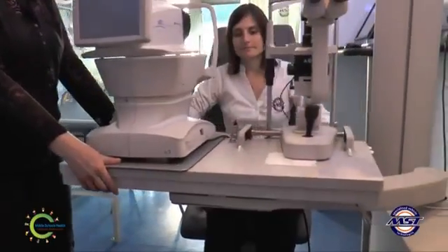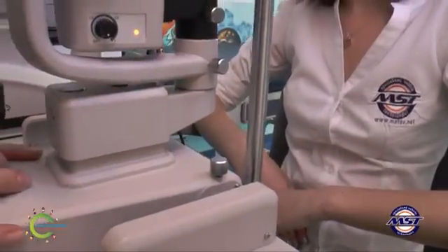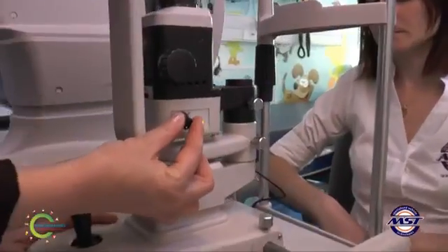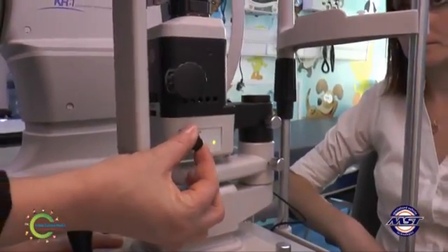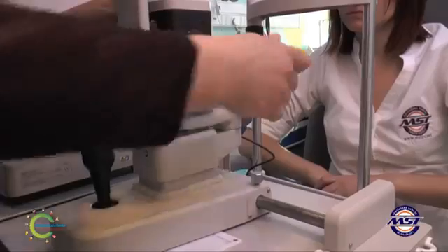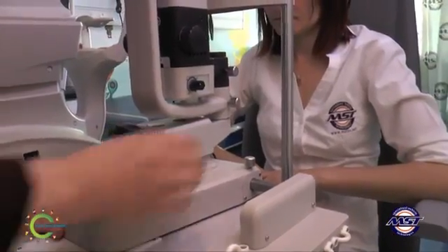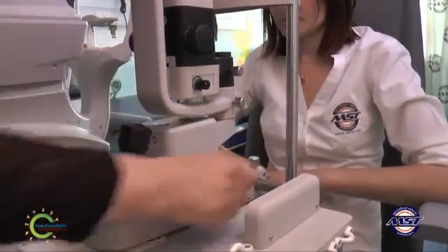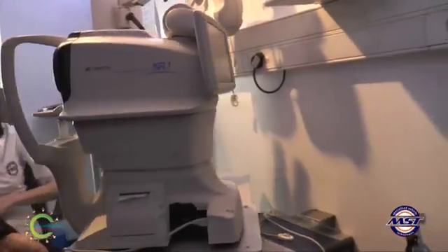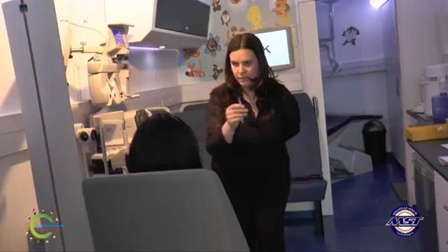The table slides across until clicking into place. Turn the slit lamp on with the button on the side, the orange light will turn green. After completing the slit lamp tests, be sure to secure the machine back to its forwardmost position and replace the sliding desk to its original position. You can now finalize by doing the ophthalmoscopy.